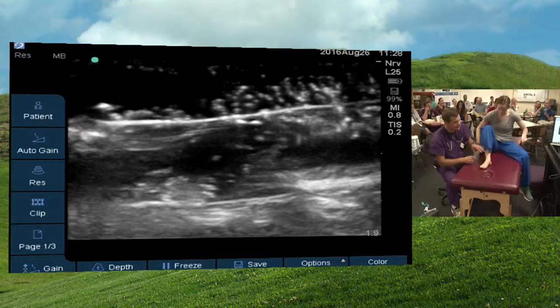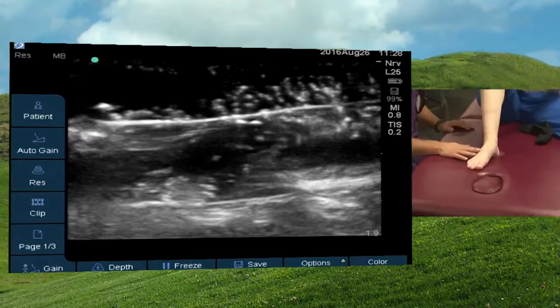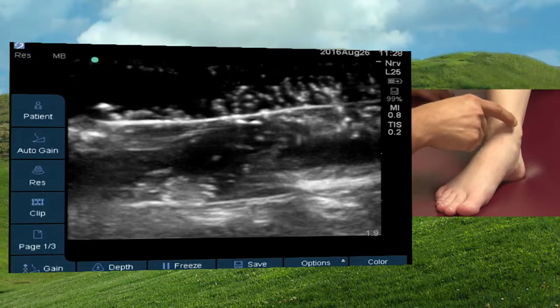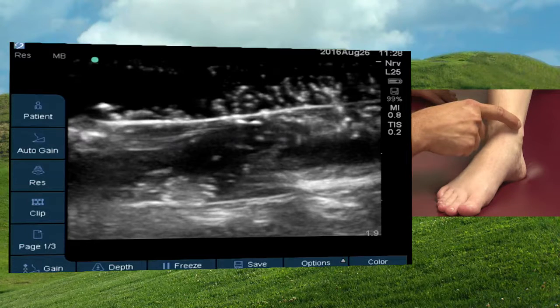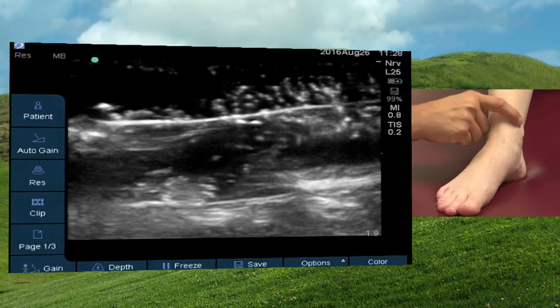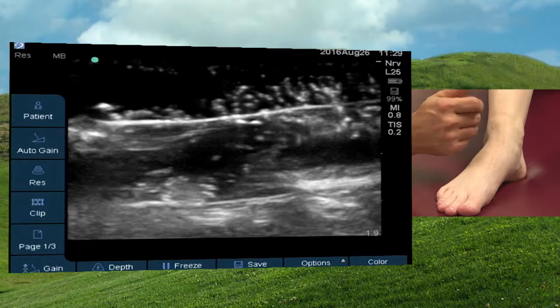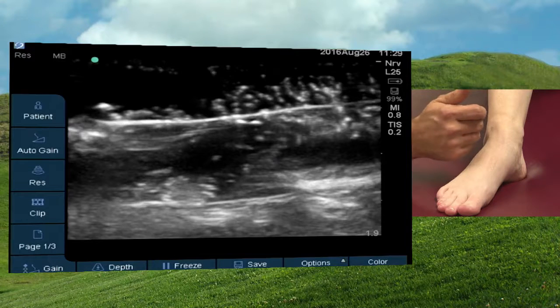So everyone has veins on the feet, of course. As we get older, they're not as good. Right here, just superior to the medial malleolus, there's the saphenous vein. That's a great vein to use. In older patients, it's a lot of time obliterated. It's great for peds. So if you have a little kid in the ER, look for it. A lot of times it's tough to see. If you have a child with particularly thick skin, you may not see it, but you may need to ultrasound it. You can probably feel it.